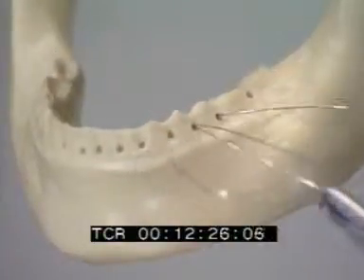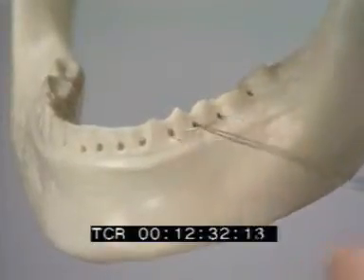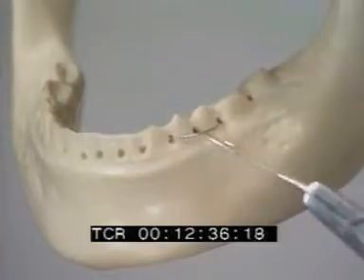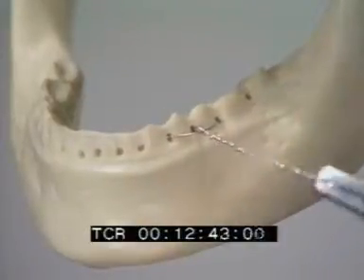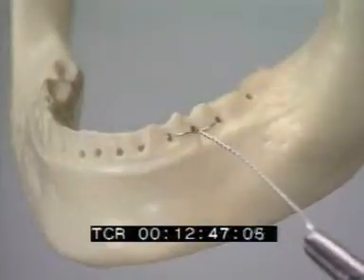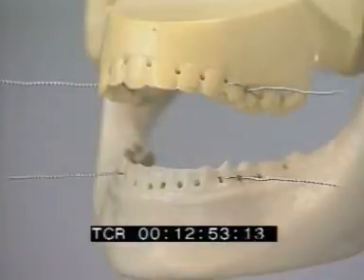One wire end must pass below. The other end must pass above the horizontal portion of the wire on the buccal side. The wire is then tightened with the wire twister. It is of major importance to preserve wire ends of at least 4 to 5 centimeters length.